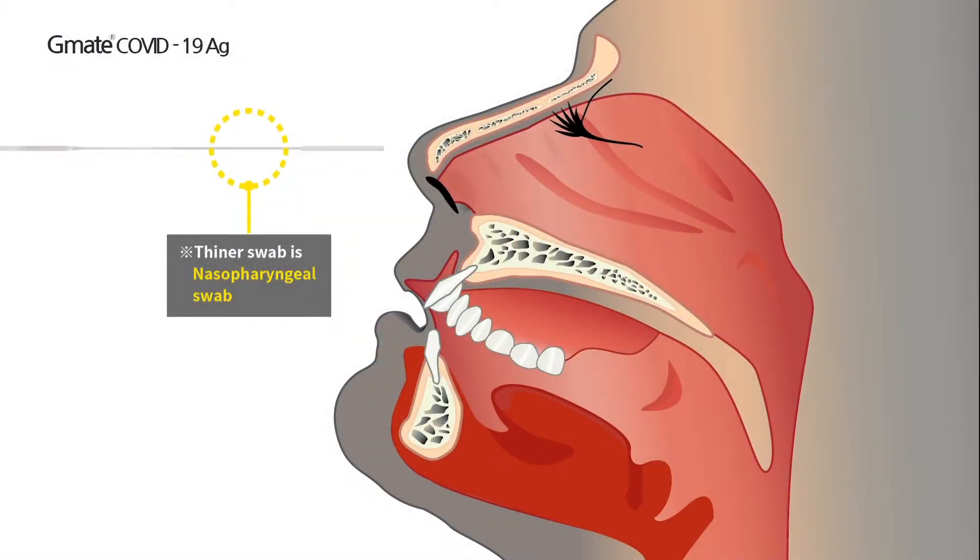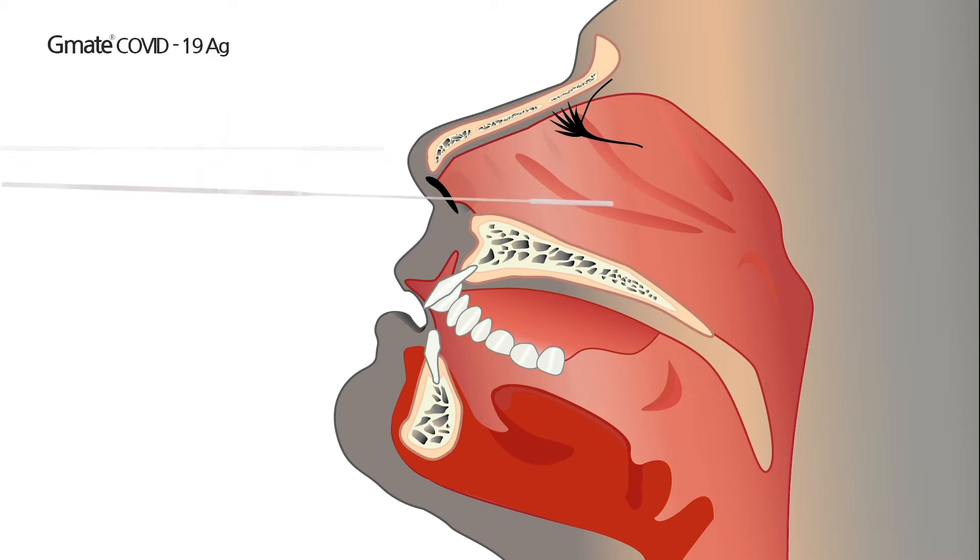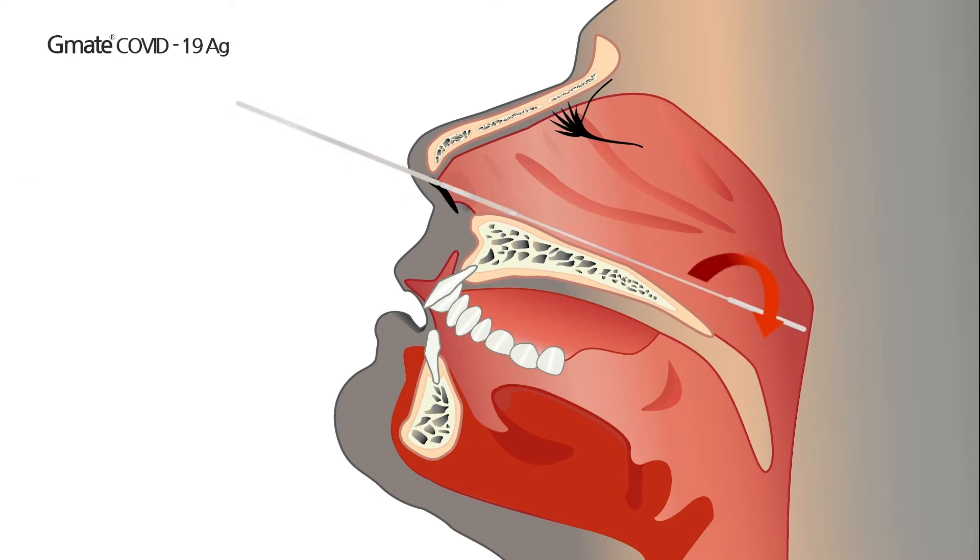Nasopharyngeal sample collection. Tilt the patient's head back 70 degrees. Gently and slowly insert the thinner swab through the nostril, parallel to the palate, until resistance is encountered. Gently rub and roll the swab, leaving it in place for several seconds to absorb secretions. Slowly remove the swab while rotating it.